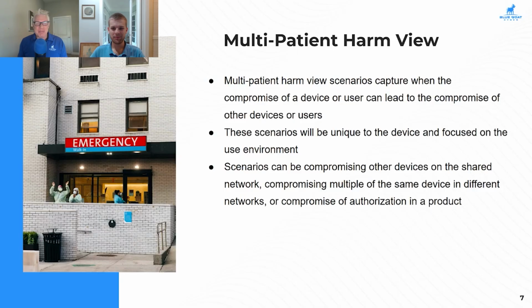Log4j. But if that compromises one medical device, then technically it could compromise that same device at multiple healthcare delivery organizations, which could affect multiple patients. Is that the lens we're looking through here, or is it a little bit different?